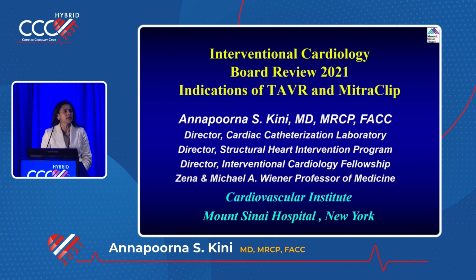Remember, the cage is metal. So the nice vessel wall, which actually is pliable, now you have a metal wall that's rigid. Not the Sapien, but if you're talking about the CoreValve, in that situation, you have to go with the smaller catheters. So if it is FL4, FL3, like that. Why we said Amplatz is because the way it is made is smaller, 1.5, it can go into the right as well as the left easily.